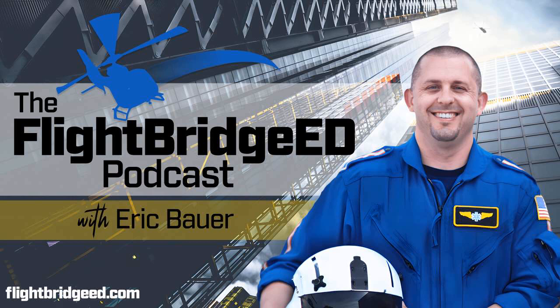If we change our rate, that ratio changes, and that ratio changes based again on our I time, and that is again then reflected on our overall I:E ratio, and whatever's left over is our exhalation time. So a standard adult, we need a 1-to-2 I:E ratio.